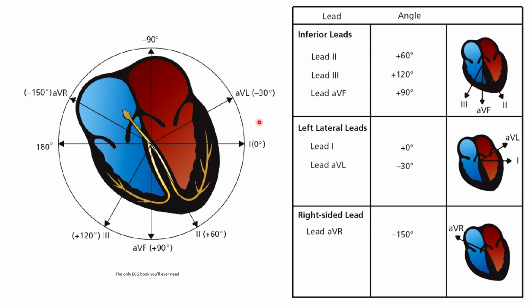And now I can even summarize it into the anatomical sites that they look at in the heart. First of all, remember, if we combine all these 6 leads that we talked about, from lead 1 to 3 and from AVF to AVR, we call them the frontal leads, because they look at the heart from a frontal point of view. In other words, they talk about up, down, left or right of the heart, whereas the chest leads talk about the horizontal part of the heart.